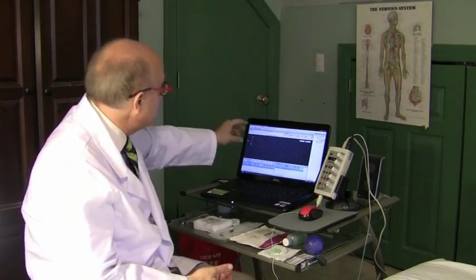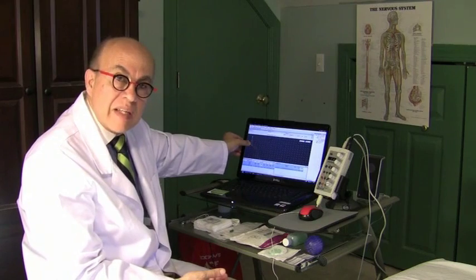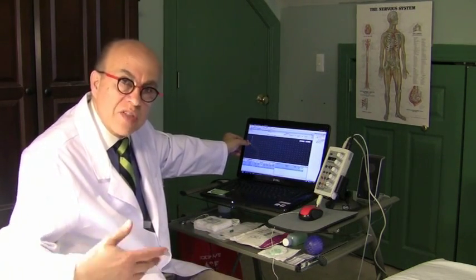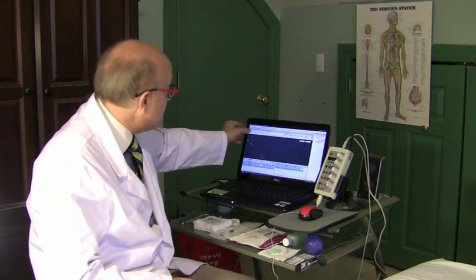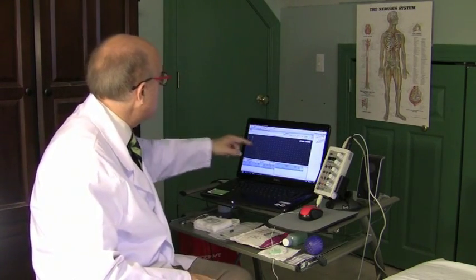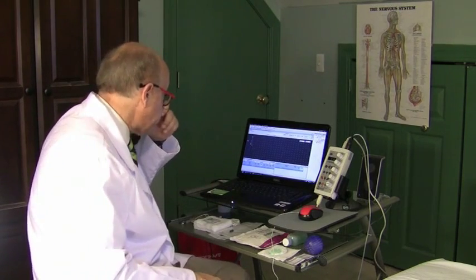Because sometimes the nerve gives you a lot of artifact, and sometimes you can't really tell exactly where the onset latency is or the distal. I'm using onset and distal interchangeably. Onset and distal is the same, where the distal latency is, but everybody can identify where the peak is, so sometimes they use the peak latency. And now they use the return to baseline. That's number 3.